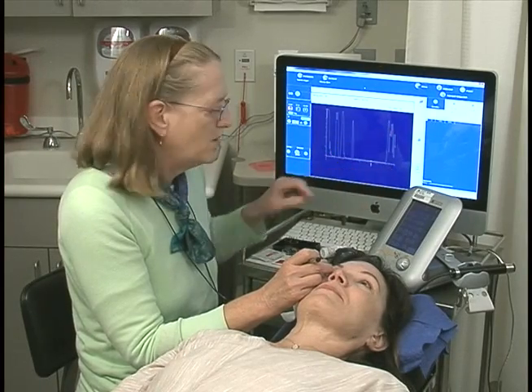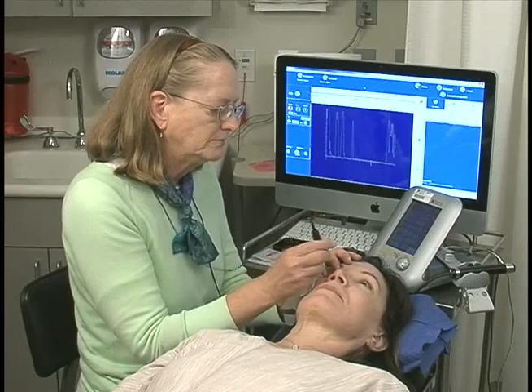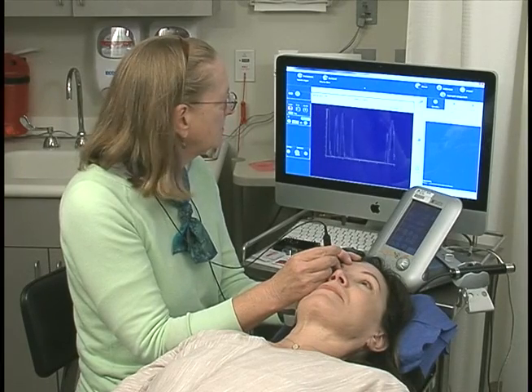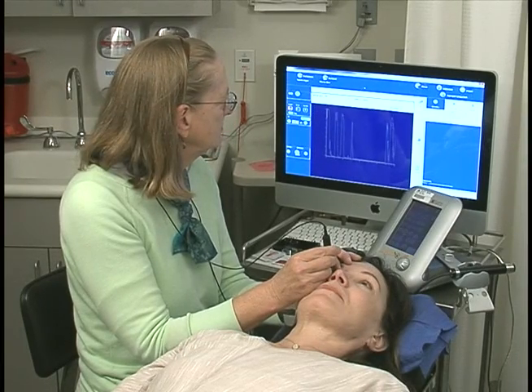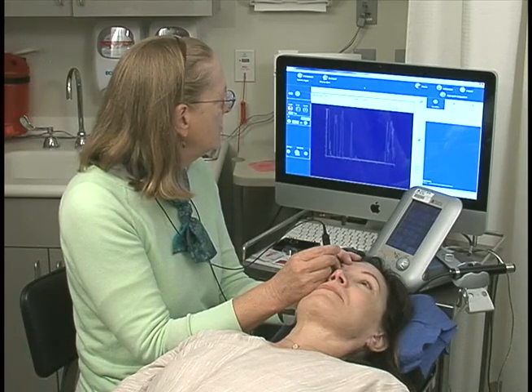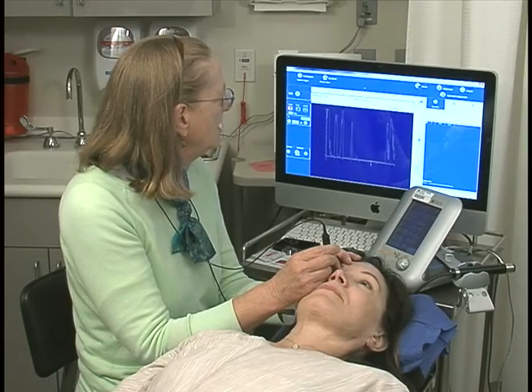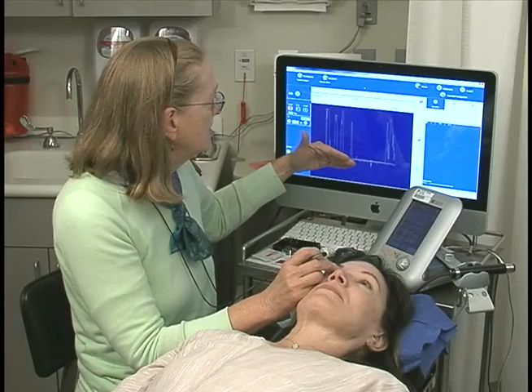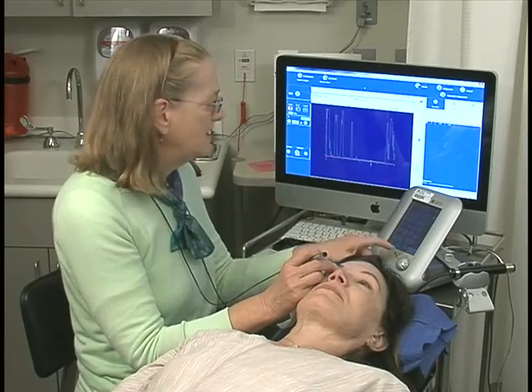I'd like a sharper echo on the retina. I'm working with slightly lower gain because I really would like to obtain tall echoes because I was perpendicular to the tissue, not just because I turned up the gain.